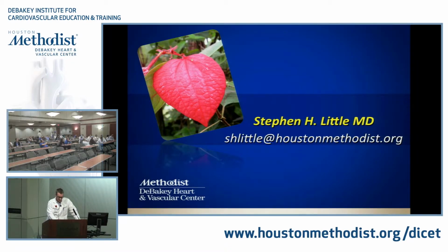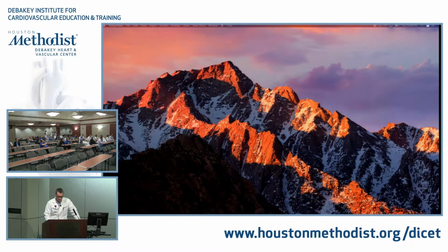All right, then I want to change gears real quick and do something a la carte. I want to show you a few slides that I presented at ASC last week. It's a short little talk. I thought I'd just give you an update on TMVR because it's something that we're very much involved in, and it was a point of confusion, some of the terminology.